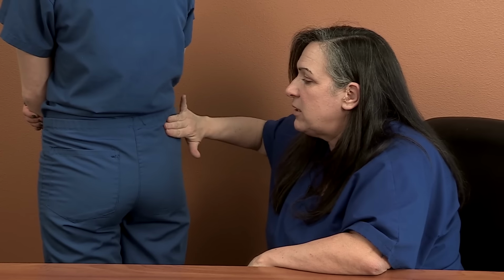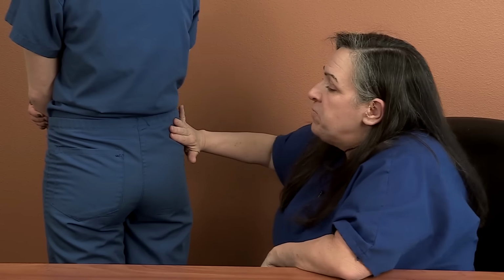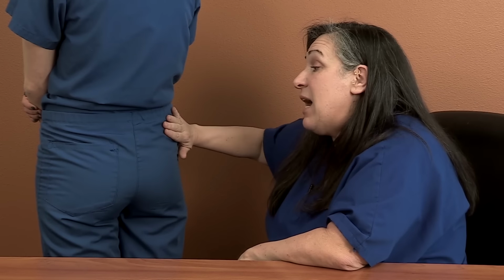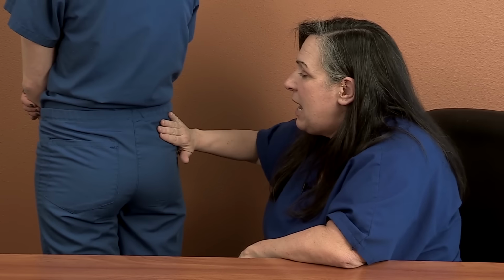Afterwards, I like to do a little massage. Try to spread that medication out a little bit. And again, for comfort, most folks go ahead and rotate, going back and forth. I have other folks who really want to sleep on one side of their hip and not be sore, so maybe they choose to do all their shots over here so they can sleep comfortably over here. Doesn't matter to me. Whatever works for you, certainly.